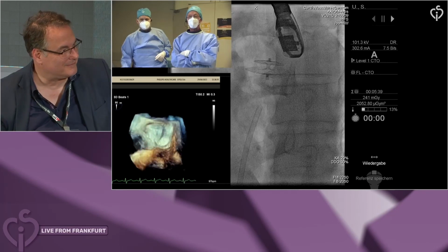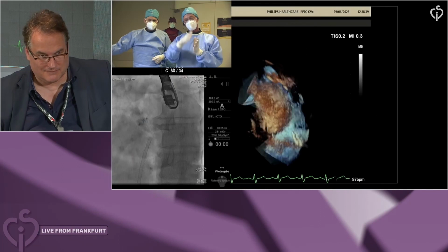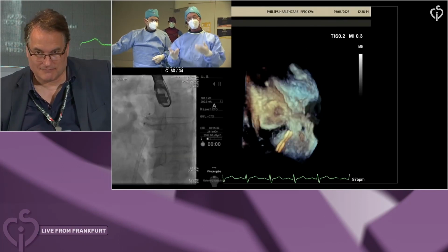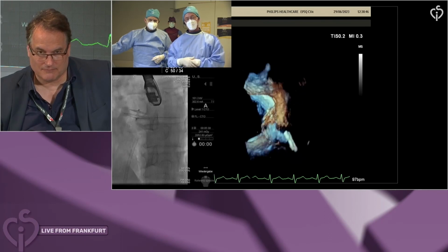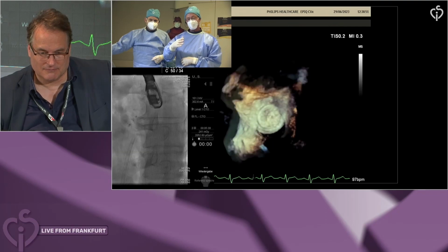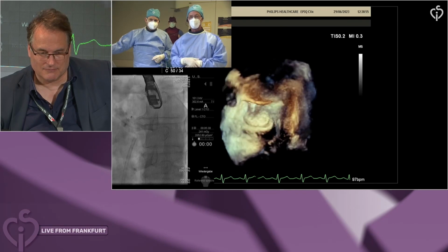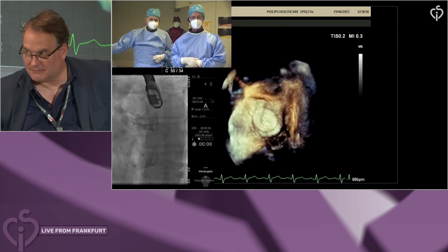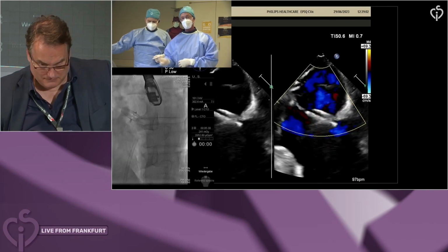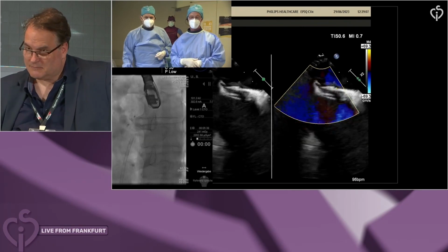Well, when I don't have it, then I do the angiography, so I see where the PFO is. I see the septum secundum, I see the septum primum. And then during deployment of the device, I also give contrast when the left atrial disc is opened and pulled towards the PFO. Then I do an angiogram. And also after deployment of the right atrial disc, I do another angiogram. I see, you use angiography. Important is high speed, so 30 cc per second and 20 cc volume.